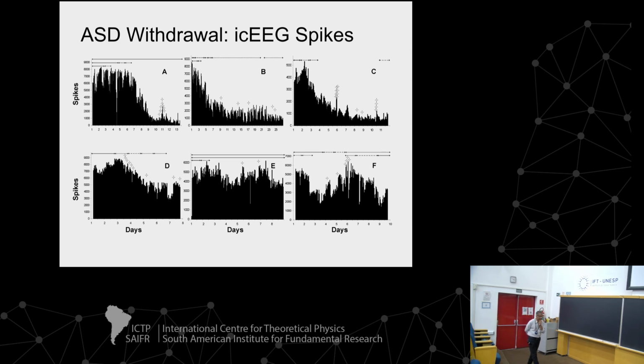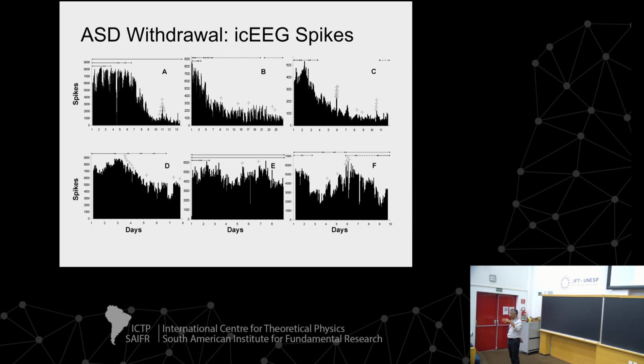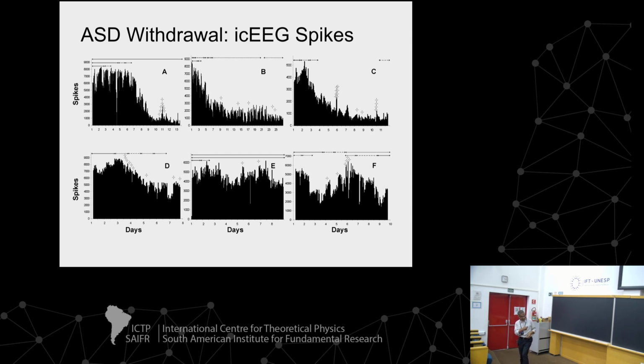I'm not sure that there is an increase or not, but in the first few days of monitoring, you have to keep in mind the patient has a surgery on a given day, 1 day of recovery in a neuro ICU, and then comes into the monitoring room. This is early from the time of surgery, and we place a fair number of electrode contacts in these brains, so it's possible that the brain is still reacting and settling down. But I'm not sure that this is truly an increase and then a decrease. The one dynamic I'm fairly sure of is that it's relatively high and then low. But for the individual changes, your eyes might have picked up this increase here. Yes, we do see some of these fluctuations. We haven't quantified them fully.